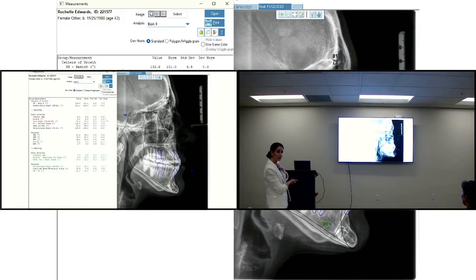Quick question. With the wisdom teeth being so short, sometimes with the clinical crown, do you ever have issues with Invisalign not seating well in that area? Or do you put attachments all the way on the wisdom teeth as well? I never put attachments on wisdom teeth. Oh, like not seating, like bouncing? Yeah. Make sure you have attachments on your 7s. Got it. If you don't, the aligner goes pop, pop, yeah.